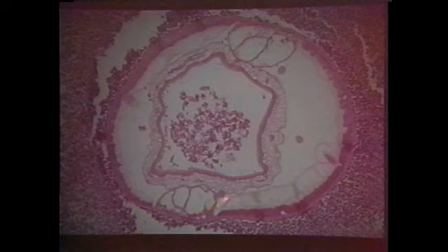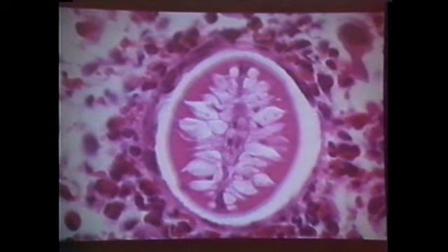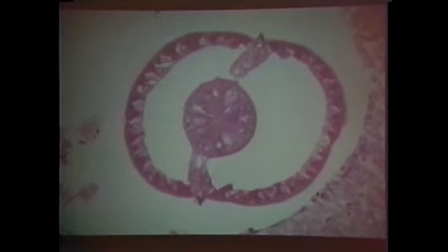Piece of cake. Look, here we go. Look, this is one muscle cell. Do you see how that's smooth? Do you see how this is not? Okay, now look, you've learned something. You've got your money's worth. Now, sometimes, here we go. What kind is this? This is coelomyarian, and so is that. Do you see how that's not smooth?